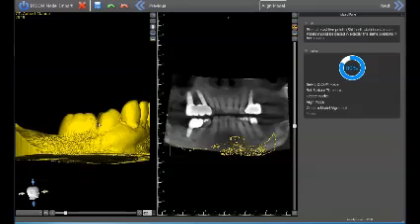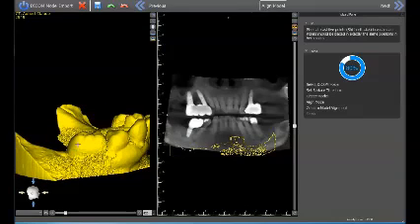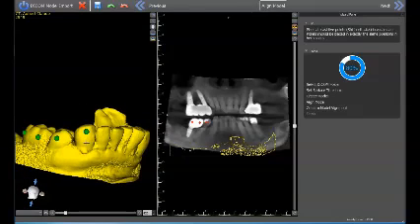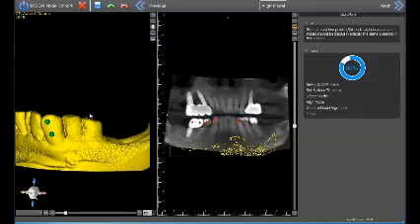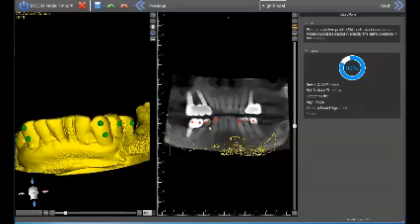So we'll plot some marks on here, 2 here for the molar. I usually do 2 for molars and singles. Canines I usually give 2, but in the vertical direction. And then maybe like over here again for this and this, and maybe like 1 in the anterior. 1, 2, 3. Let's see, 1, 2, 3, something like that.